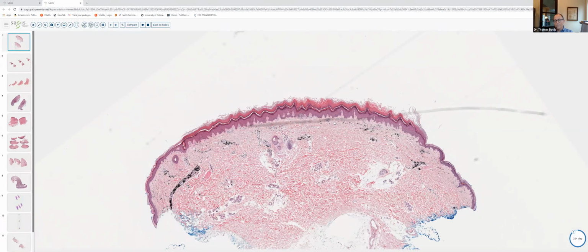So they went ahead and did a biopsy, but these spherules that are either gray-brown or gray-blue and calcific are very characteristic of Radiesse. And you want to make sure that you can identify the key classic fillers, because you're going to be tested on that.